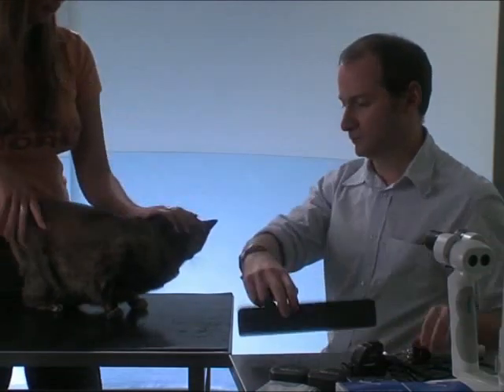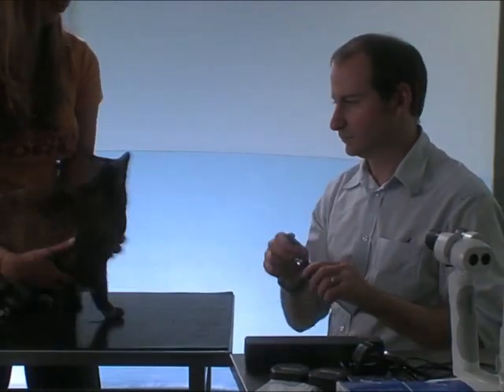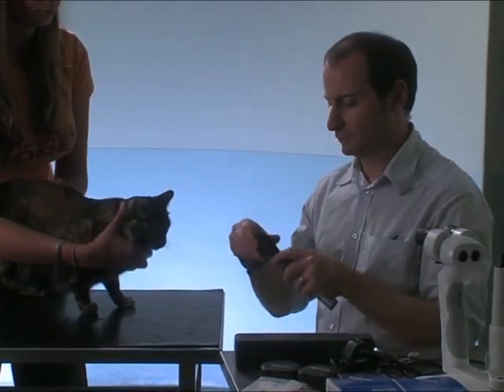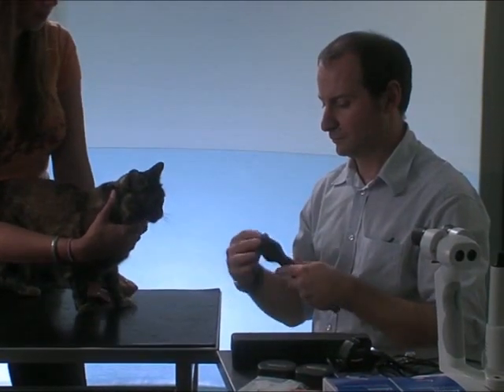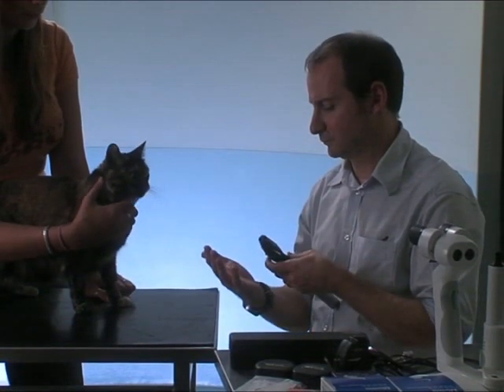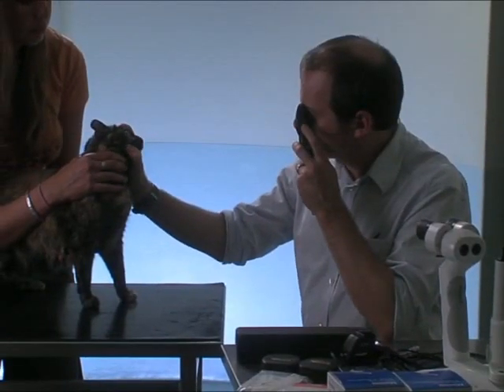Distant direct ophthalmoscopy is a simple and extremely useful procedure. The room should be dark, but the pupil does not need to be dilated. The lens cartridge is set to +1 or +2 compared to the setting for the fundus, in the case of this examiner, to 0. The ophthalmoscope is held close to the examiner's eye and the animal is examined at arm's length.